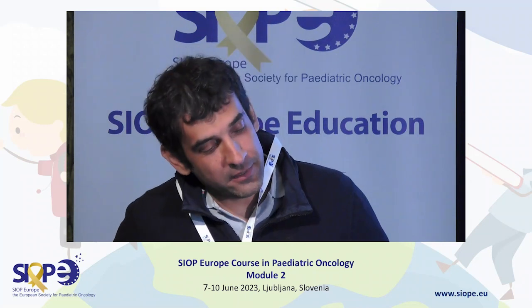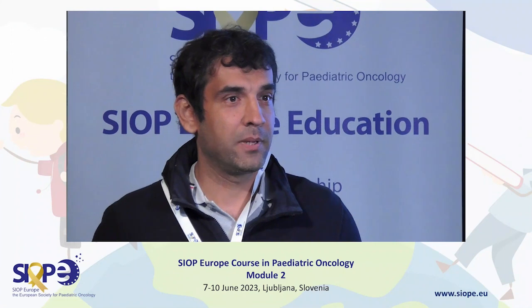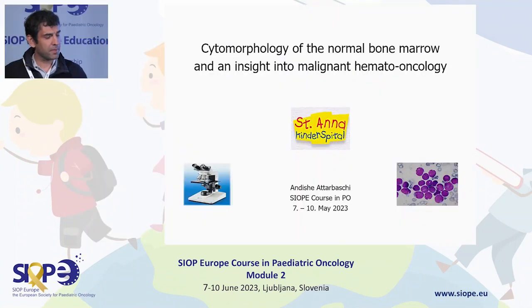The idea behind this presentation is not to replace the pathologist, but I think as a pediatric oncologist, being aware of cytomorphology, of cytology, is important because usually the patients with AML-M3 or an infant with hyperleukocytosis or an M5 come in on a Friday afternoon or on a weekend, and I think most of you don't have a pathologist available at these times, and you have to make the diagnosis yourself.